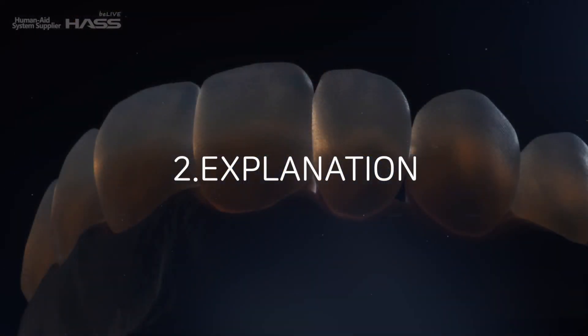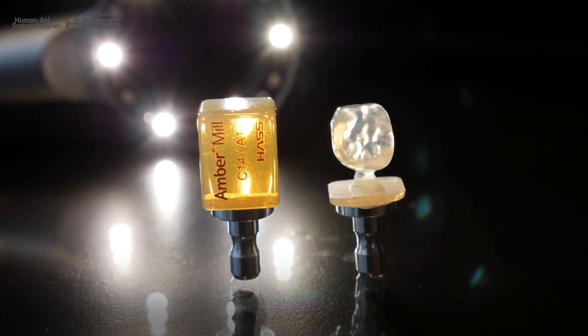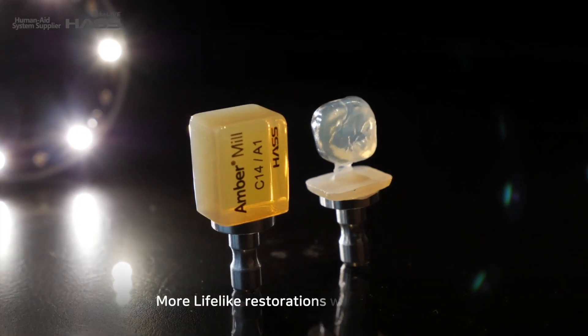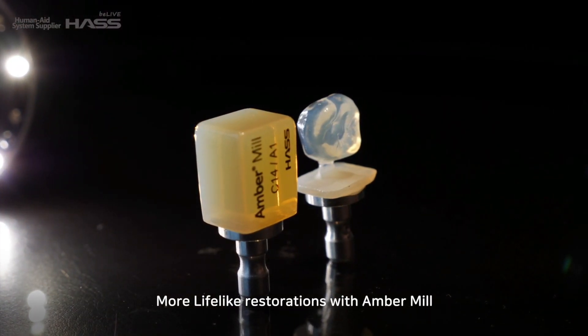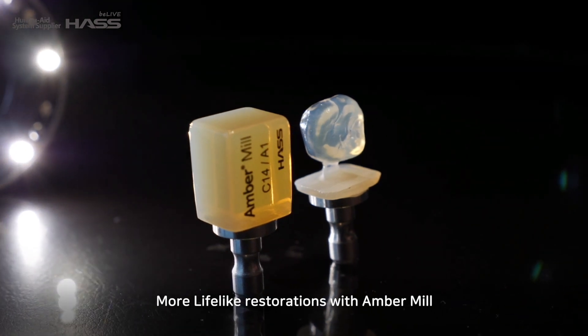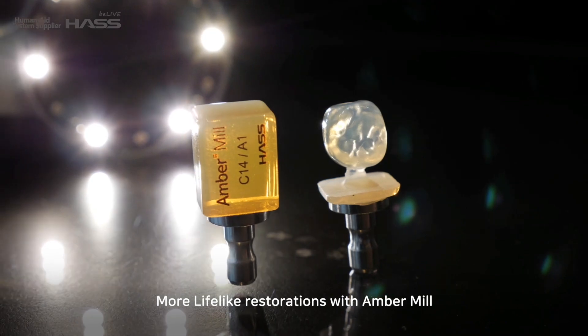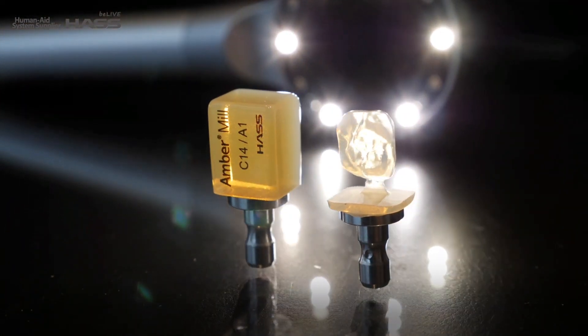Before we start demonstrating, I'd like to briefly explain the material. Amber Mill has great natural fluorescence, and it will help dental technicians achieve more lifelike restorations. Before crystallization it has 250 MPa, and becomes over 450 MPa after crystallization.